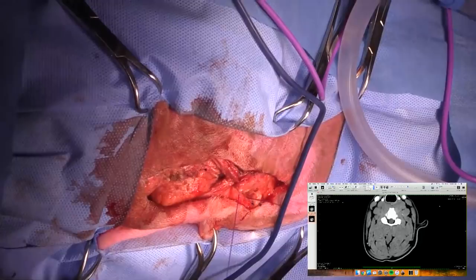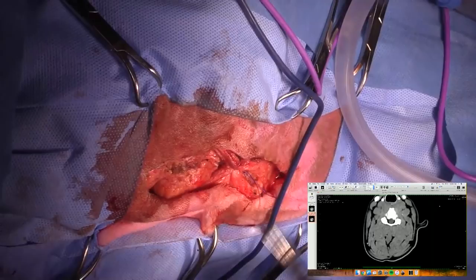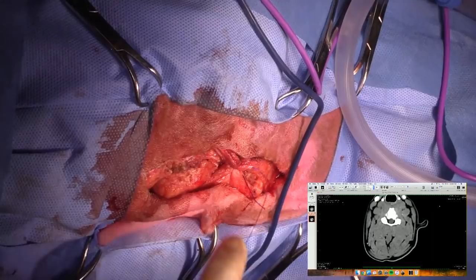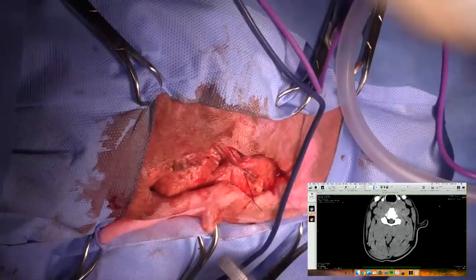So I've got Jeff working on the abscess over here. Hopefully we'll find a big grass seed. And when we find it, or if we find it, I'll bring it back into view so you can see what's going on. Piece of one. Okay, right. So we've got a grass seed sitting there. I don't know if you guys can see that. Can you move that into the field a little bit more? There we go. So that's a grass seed sitting there. That's exciting. Just what we were looking for.